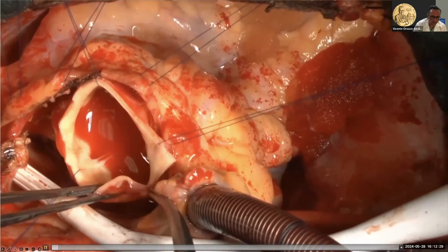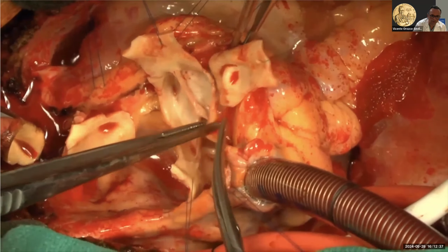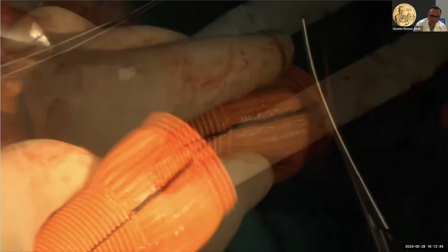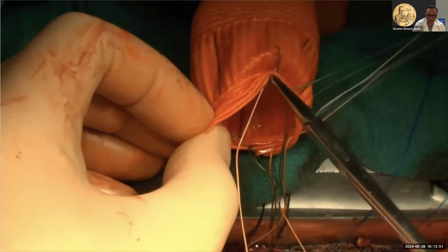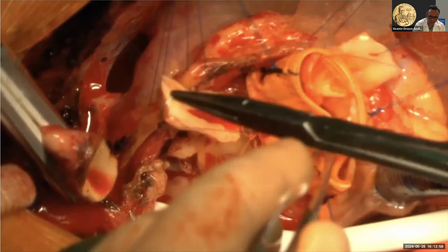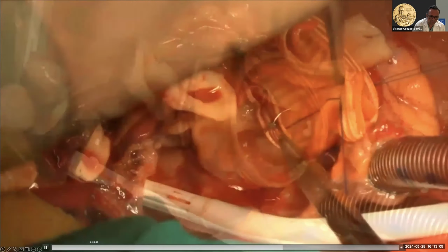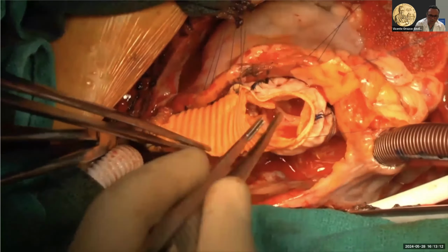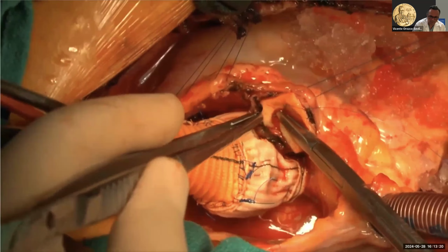It starts with dissection of the non-coronary sinus, leaving some remnant of tissue, and dissecting the left and right coronaries out. This dissection has to be deep down in the root. We put some stitches to stabilize the annulus, and then the graft is sized, upgrading to 5 millimeters more than the size of the annulus. Then the valve is sewn, resuspended inside the graft. As you can see, the valve is competent and it's perfect. Then we continue with the rest of the operation, replacing our ascending graft and reimplanting the coronaries.